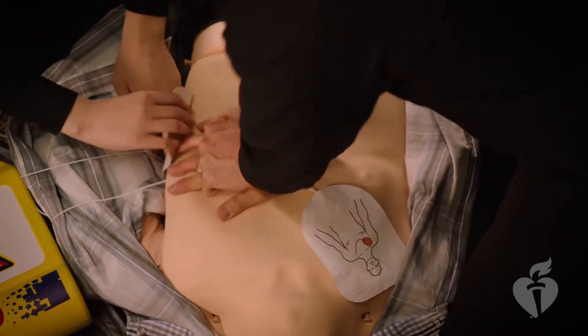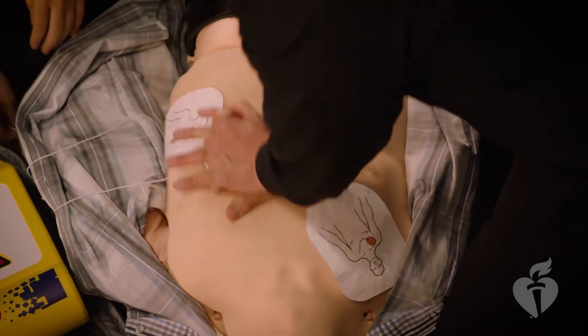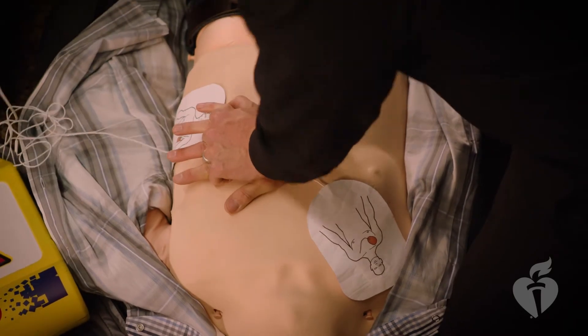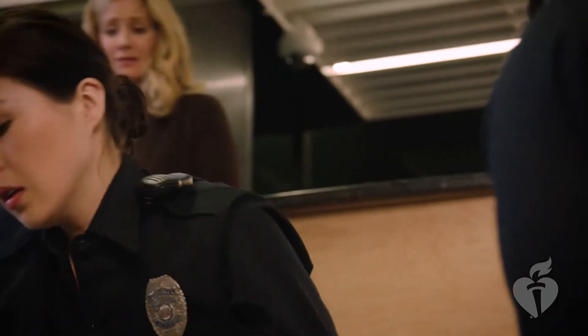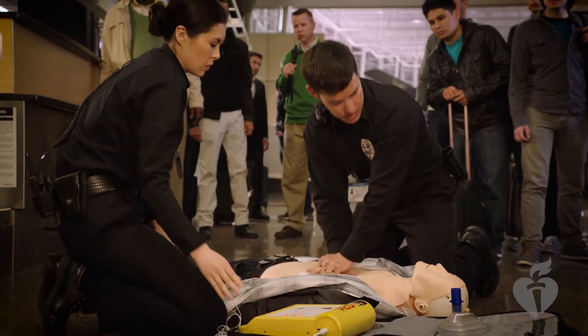3, 4, 5, 6, 7, 8, 9, 10, 11, 12, 14, 15, 16, 17, 18, 19, 20. Analyzing rhythm.